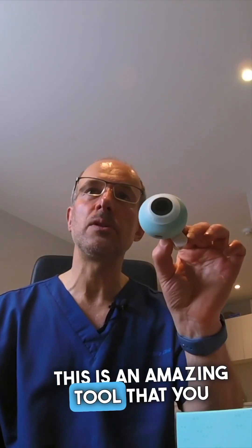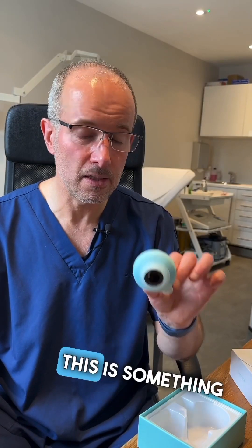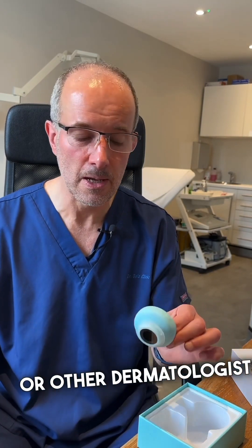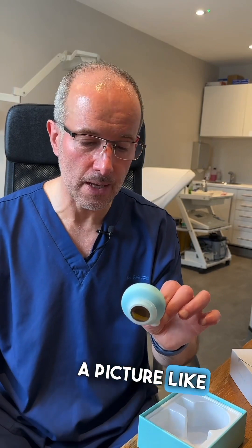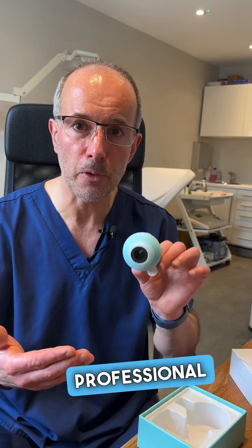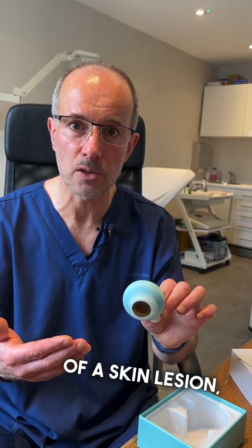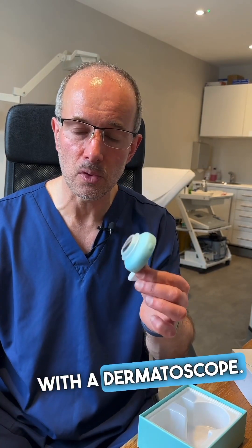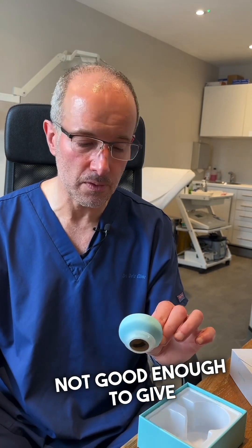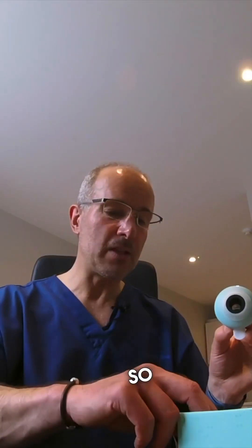This is an amazing tool that you can use to take good quality images of your skin lesions. If you send a picture taken with this device, I as a dermatologist can have a look and give a professional medical opinion on a skin lesion. With normal phone images patients send me, it's just not suitable — not good enough to give a reliable medical opinion — but with this one, yes I can.